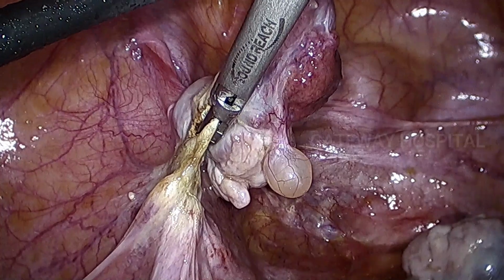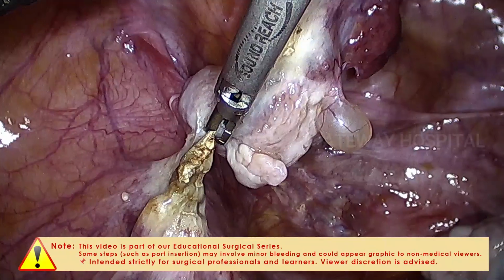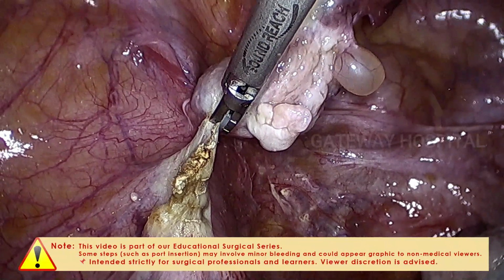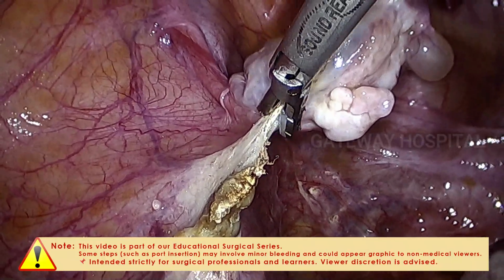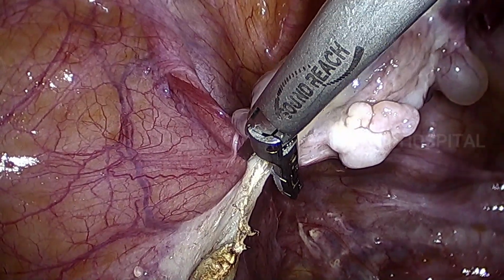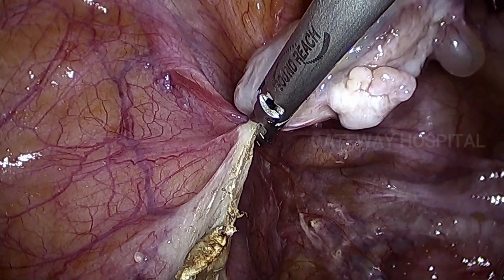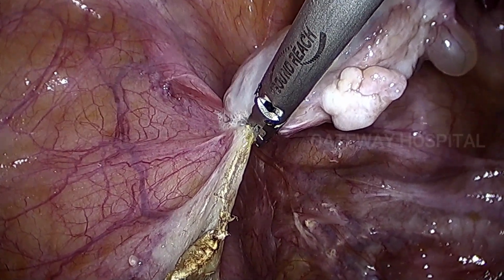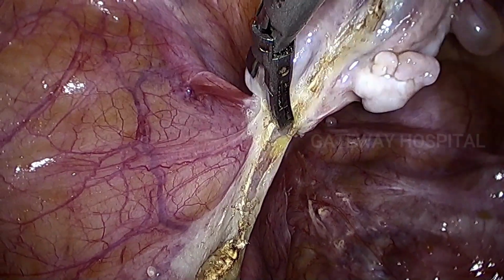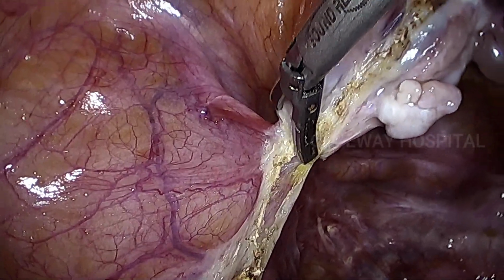As you go and progress, you can appreciate the divided round ligament on the left side. That is the round ligament which you are seeing. Now, almost we have come to the end of the left salpingo-oophorectomy. Once this is done, then both the specimens will be put into an endo bag for extraction.